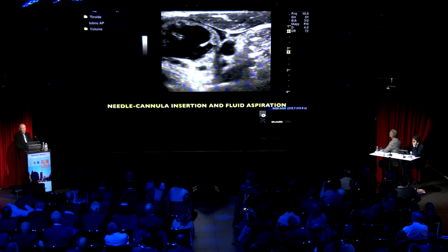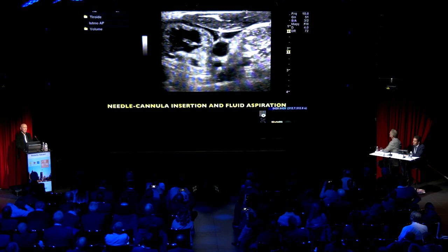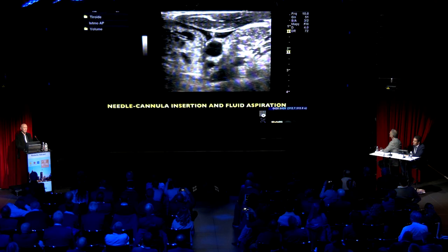Here it is withdrawn, and the three-way Luer lock stopcock is connected. And then you can see in these images clearly the cannula, which doesn't hurt, and you don't have to worry to transpass the lesion.